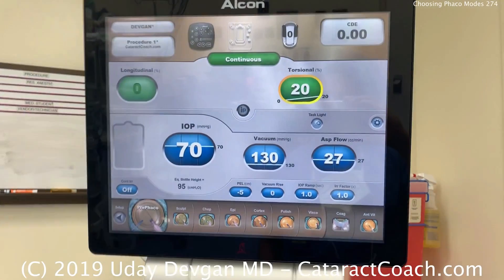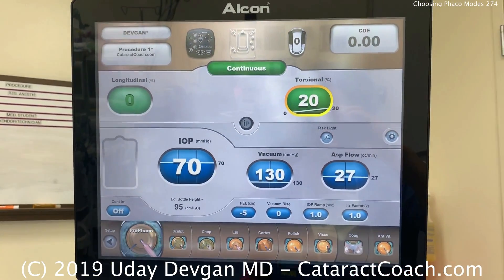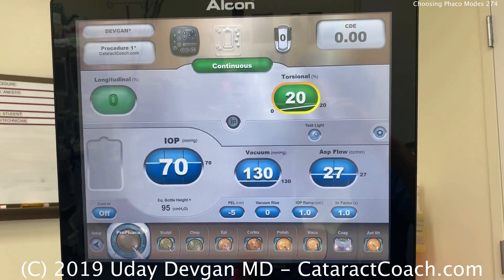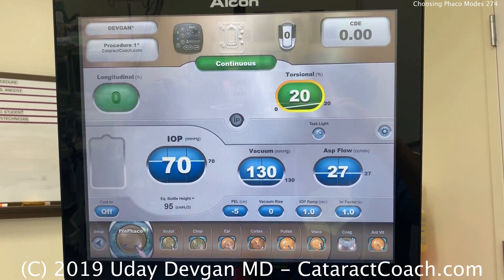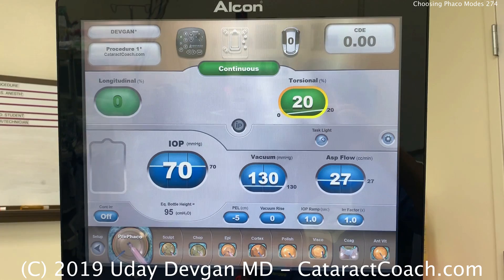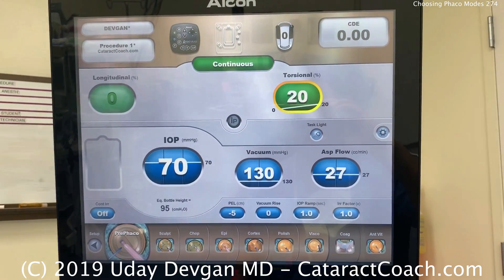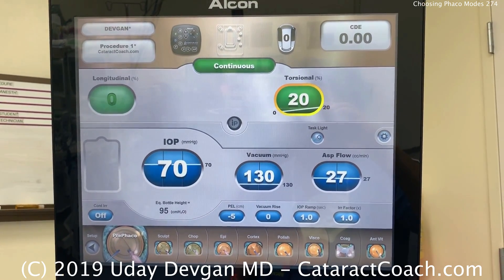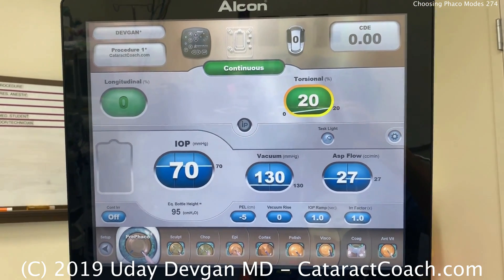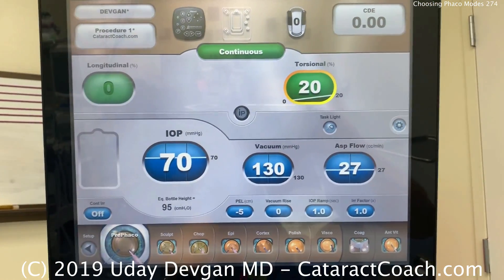CataractCoach.com. Let's talk about FACO settings — what are typical settings that we use during surgery? Let me show you some of mine. This is a normal setup at the county hospital where we teach surgery with our residents, and these are some of the settings that we're using.